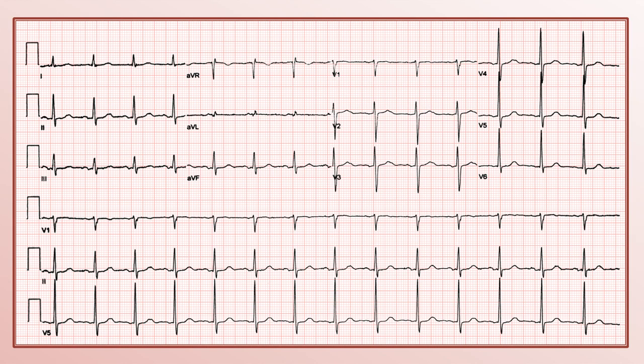Now let's talk about why the waveforms look different as one moves across the page. That's because as one moves across the page, the leads that are displayed changes typically every 2.5 seconds.